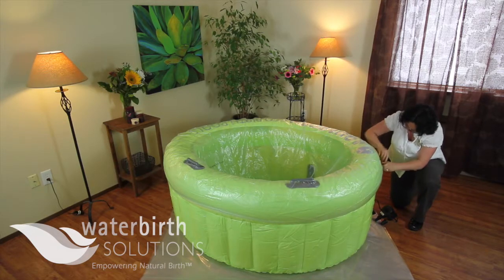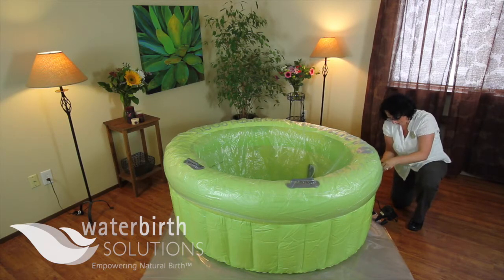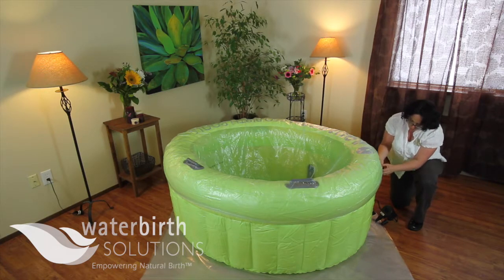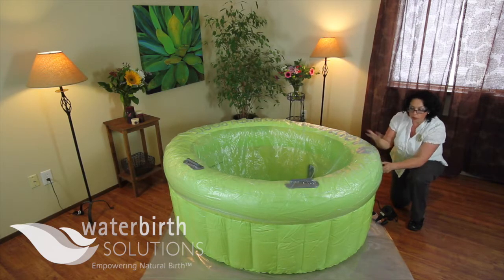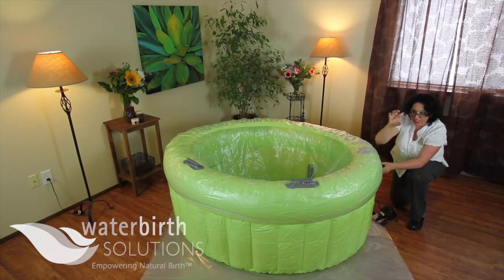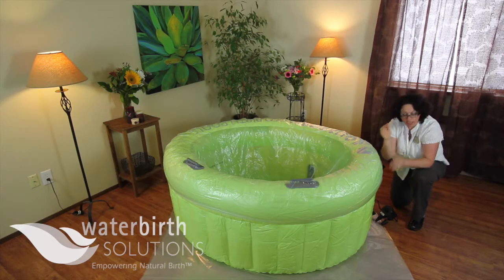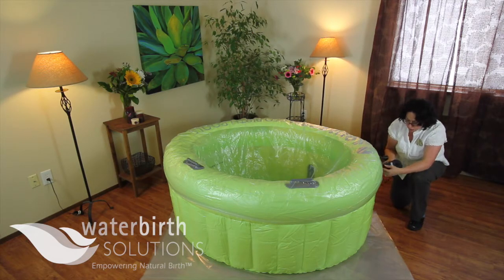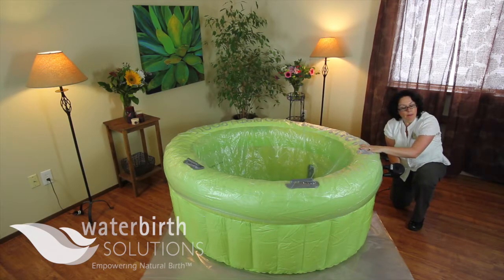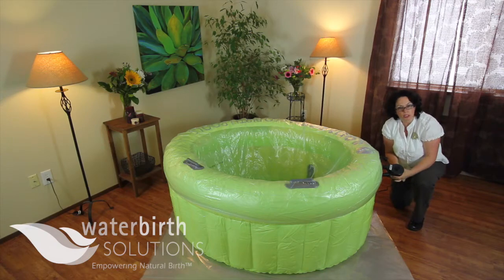The top of the valve also turns, so once you get down to where you're almost full, I should have backed off and used just the top portion of the valve. The bottom portion is a very large hole and the top portion is smaller with a little flap inside, so it allows you to fine-tune your air a little bit better. We are really close to being totally firm on top but I'm going to continue because I want the pool to be very rigid.